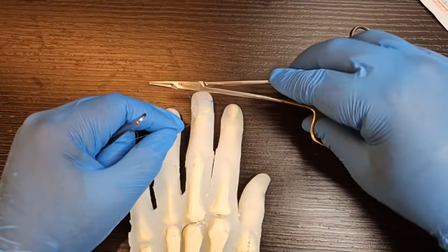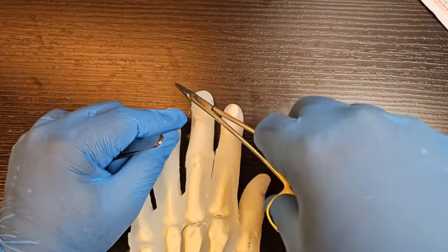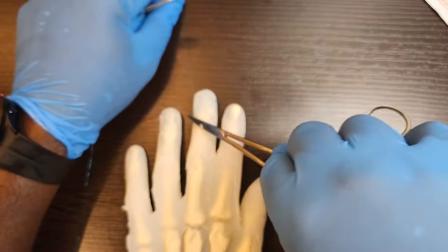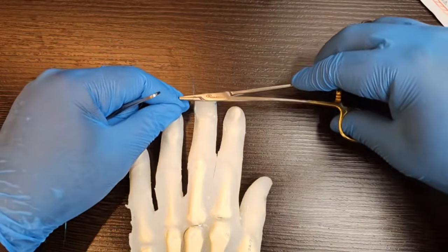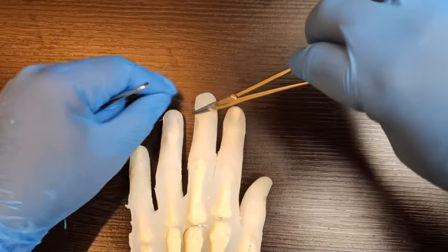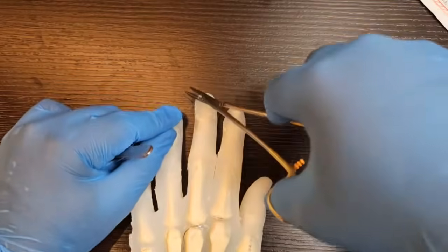Push, place, rotate. Push, place, and rotate. It's going to become my saying. Push, place, and rotate.